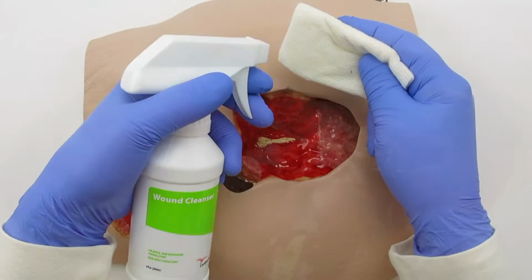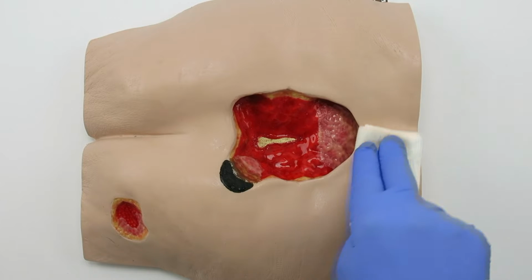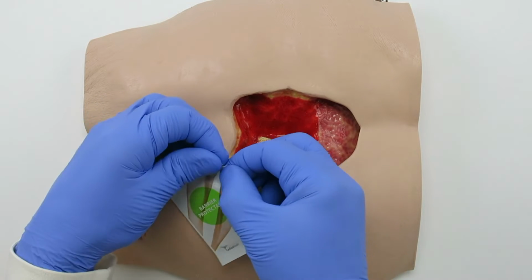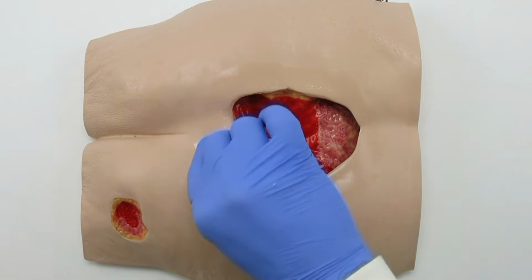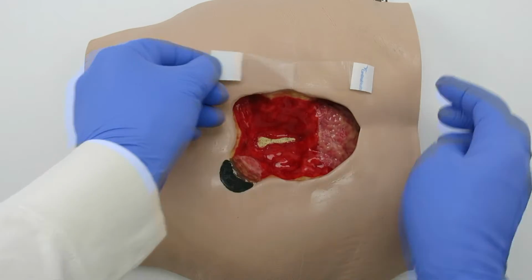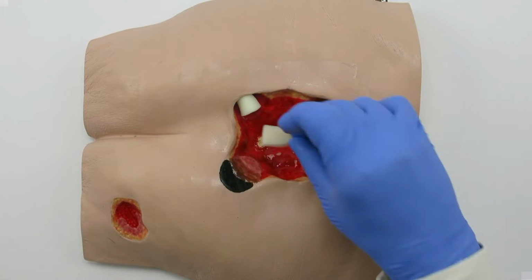After you complete your assessment, thoroughly cleanse the wound. Next, consider the peri-wound skin. Usually the only preparation needed is to clean and dry it, then apply a protective skin barrier film. If the skin is fragile or macerated, consider applying drape strips to the wound edges to provide an extra layer of protection. If white foam is used, apply a single layer only.